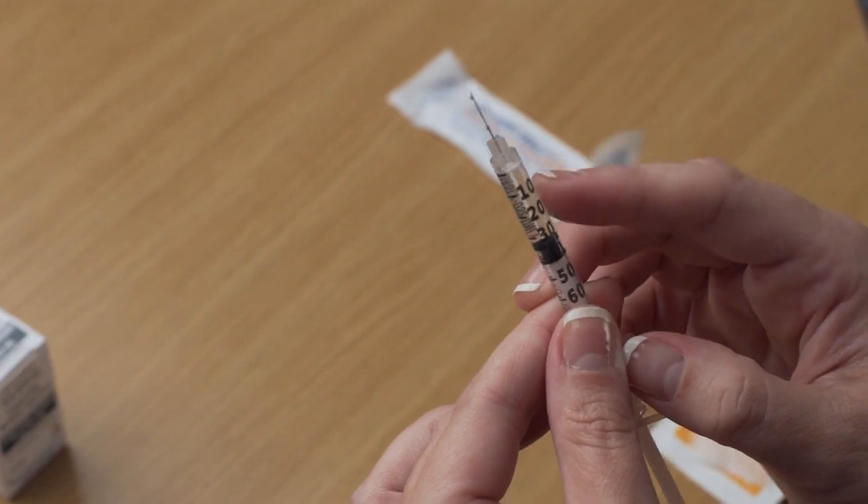Choose an injection site as directed by your Aspire provider. Common sites for subcutaneous injection include the abdomen, top part of the thigh, or back of the arm. Clean the injection site with an alcohol swab and allow to air dry. You should alternate injection sites each day.